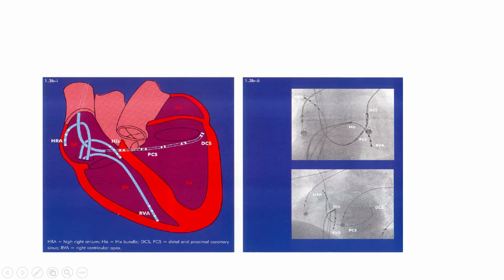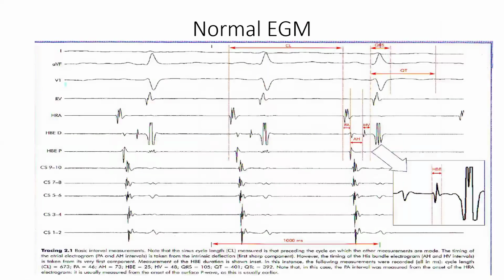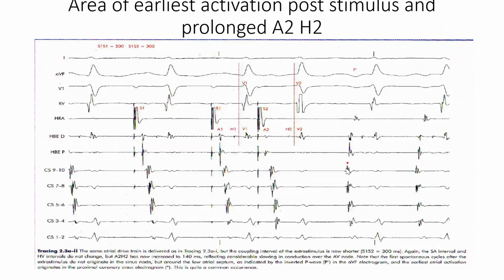Just to tell you that that's how we make the EP diagnosis of an accessory pathway. When you go back to the EP himself, the particular one, it's still confusing why this is coming first, because the one up is almost at the same line with it. So the one up is almost at the same line, right? Yes. But it's far earlier than HRA.